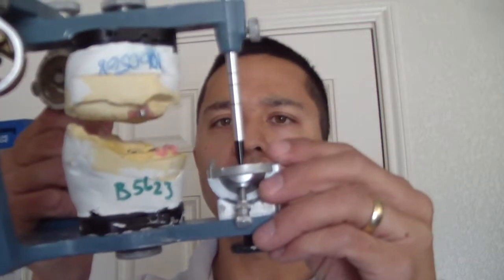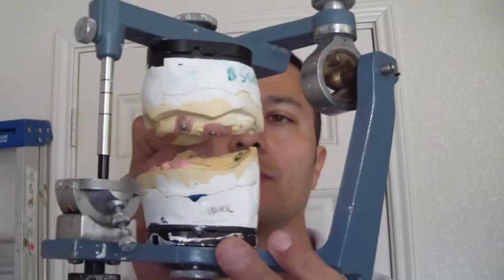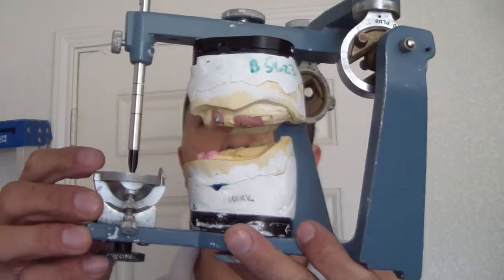Hey folks, Ashley from AllThingsEditry.com. I'm talking to you today about a titanium milled bar case we're using for a patient. This is a patient who has gone through a series of complete dentures and is now in complete dentures with locators.